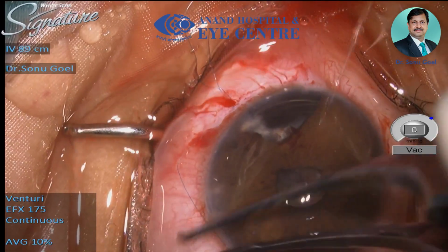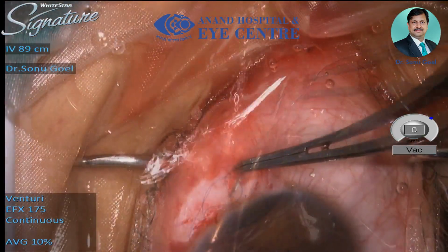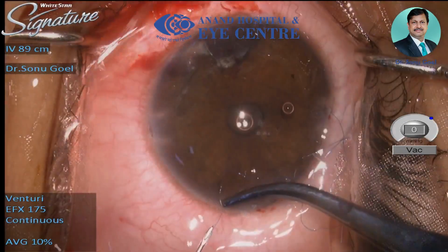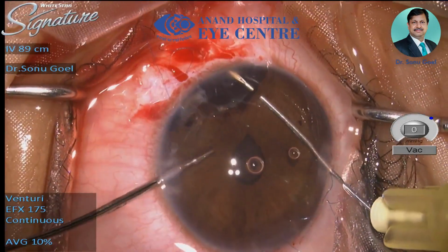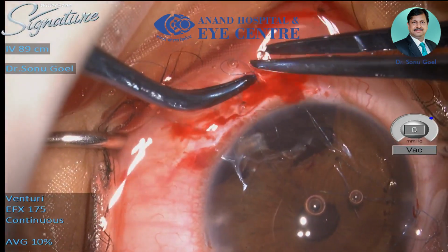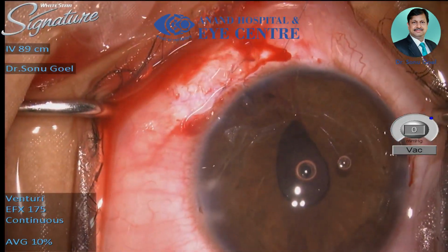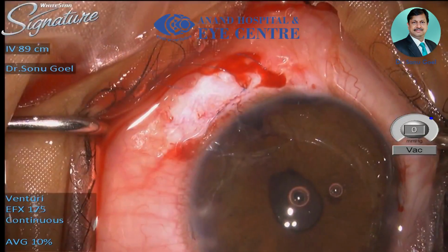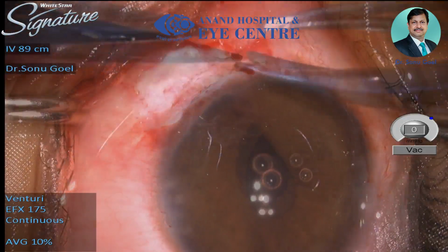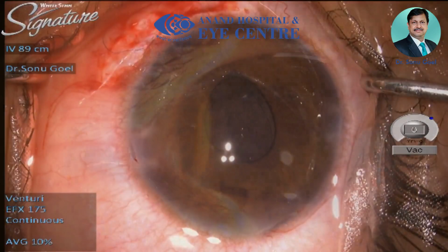In this way, the 26 gauge needle bearing the suture again delivers the suture outside, and multiple such throws would help to create a good fixation of the root of the iris to the sclera. And then finally the Prolene can be threaded through all the loops, and the loops can then be sutured and the knot can be buried inside the groove. A very good centration of the pupil can be achieved.